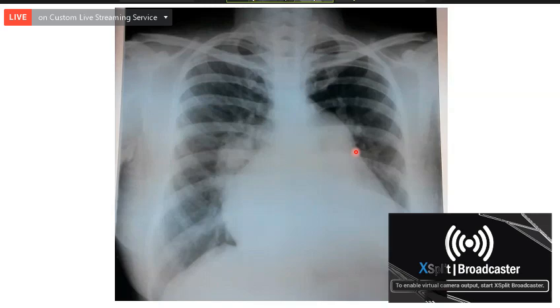Okay, so here the pulmonary segment is prominent, and how will you make out what is the cause of this prominent pulmonary segment? How will you make out whether there is an increase in the pulmonary blood flow? How will you make out whether there is evidence of pulmonary hypertension? Pulmonary vasculature. Peripheral pruning, we have to see. If there's peripheral pruning, with this there is centralization. The pulmonary vasculature becomes centralized. Central vessels are very large, but as you go to the periphery, there is a sudden cutoff. That's suggestive of pulmonary arterial hypertension. Very good, yes.